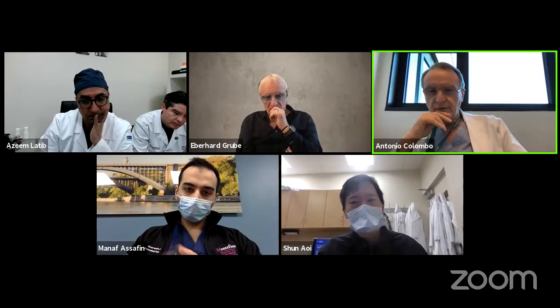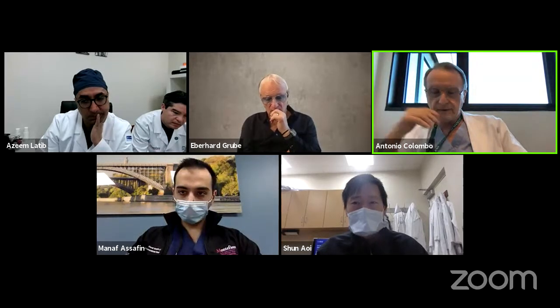And if I do total occlusions, they are the experts, so I don't want to take them away, but I prefer radial and one femoral. I don't like double radial, but it's okay. And if I use hemodynamic support, I go both femorals.